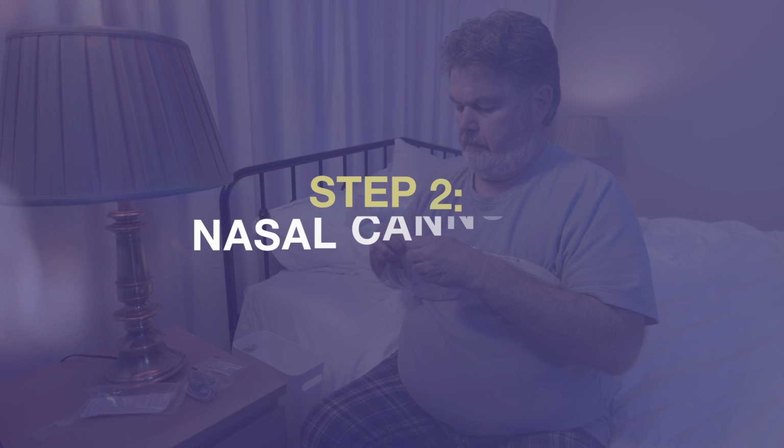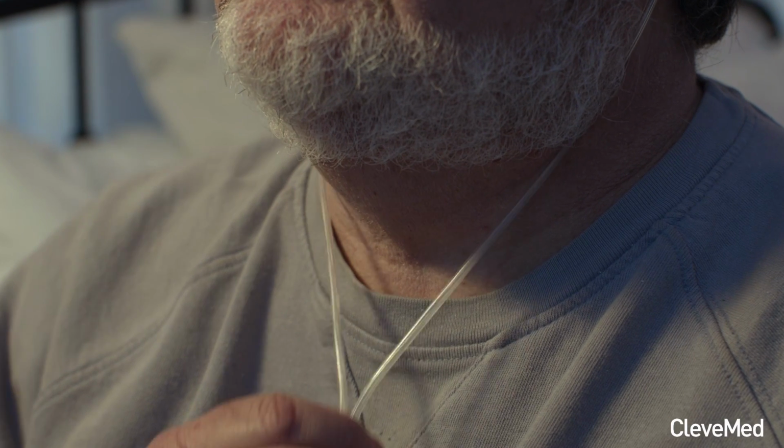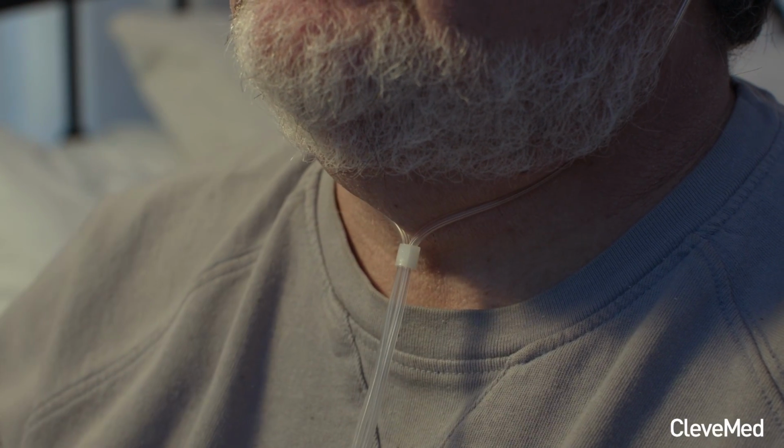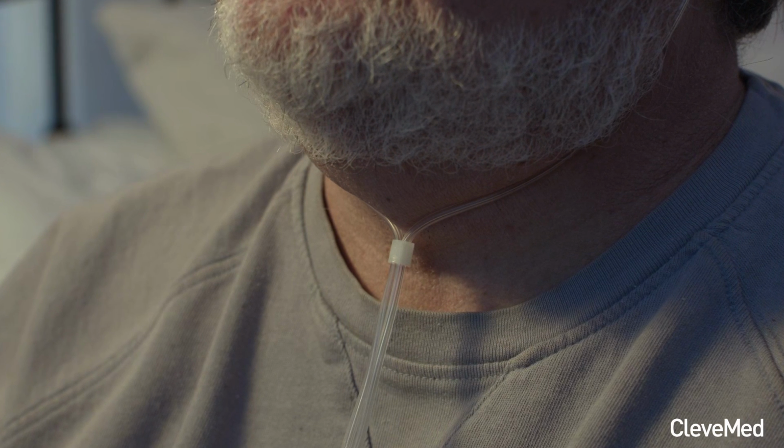Next, remove the nasal cannula from its packaging. Ensure the nasal prongs are pointed upward toward your nose. Now, gently insert the prongs into your nose and pull the tubing behind your ears. Find the plastic slide where the cannula tubes meet. Pull the slide up to your chin so that the nasal cannula fits snugly.